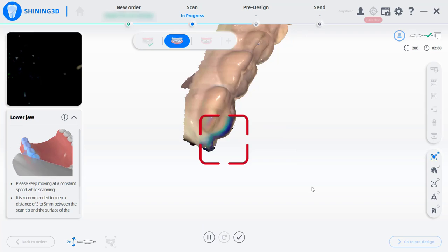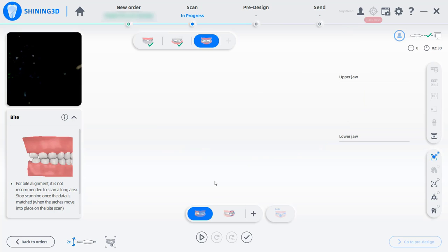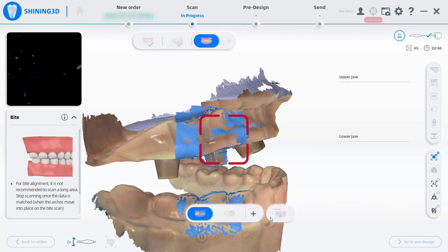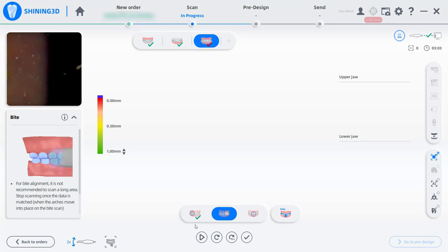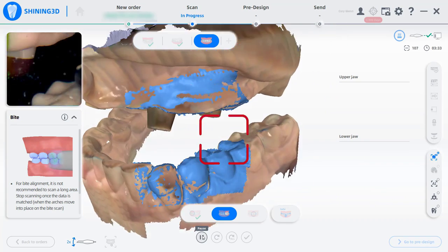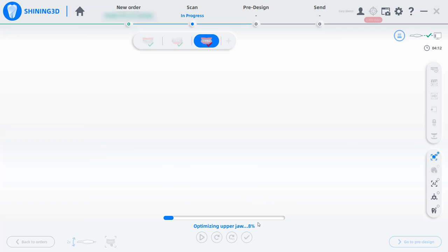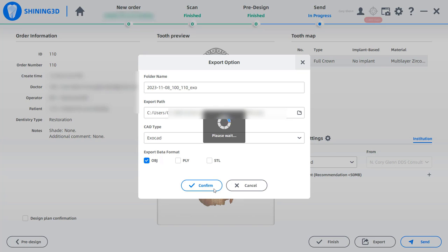Now I'm capturing the opposing, and you can see I'm capturing those models, filling in any holes in my data, and then we're going to capture the bite. That's one thing that I get a lot of questions on, is how do you capture the bite for these? And that probably warrants an entire video in and of itself. I'm doing it here on an articulator, so it's a bit hard to translate that. But you could open their bite with a leaf gauge or a Lucia jig or something like that to the correct vertical, and then have them close in that while you get a buccal bite. You could use a reference denture, a shell denture. There's a lot of different ways you can approach this, so I'll be making a separate video just on that topic. But we finished the scans, the data is processing, and that will now get exported, and we're ready to start the photogrammetry scan.